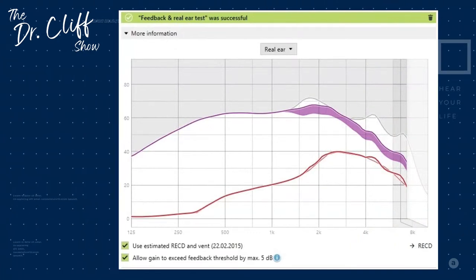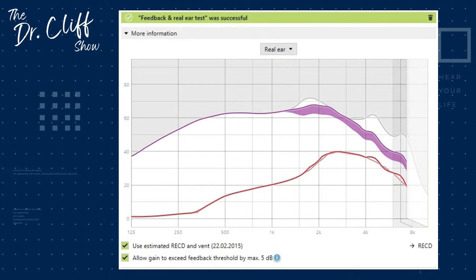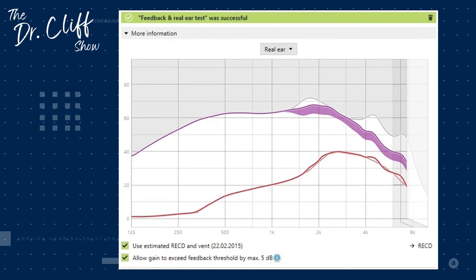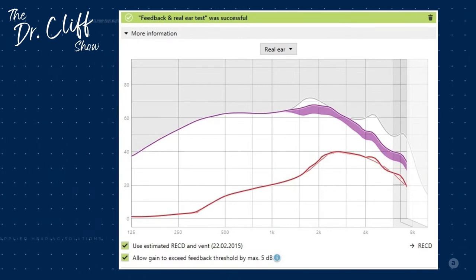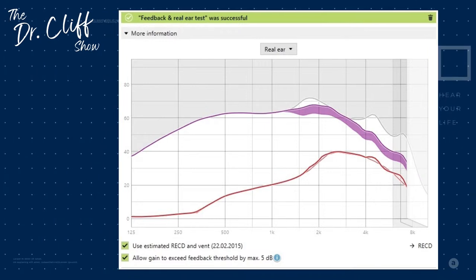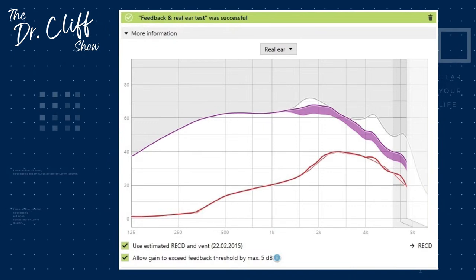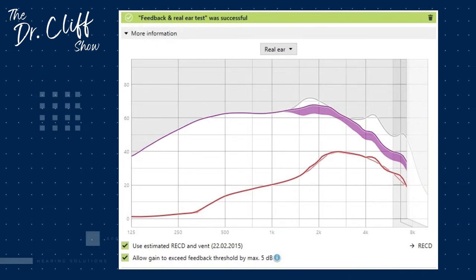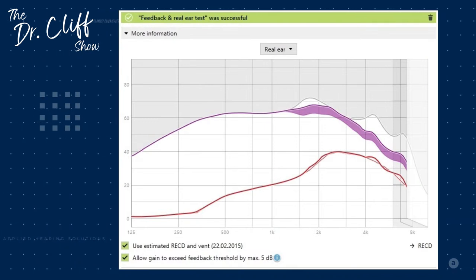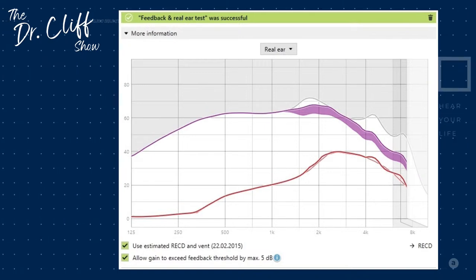And we can see this is actually a really good example of a feedback curve with a particular earpiece. I would guess in this particular case, we had a custom ear mold that is not allowing a ton of leakage of sound, which is a good thing. As long as that purple curve is hugging up against that gray range at the top of the screen and it's not cutting down into the red curve there, that means that we are not at risk for feedback. So I would say from an acoustic perspective, if we put a dome or an ear mold on someone's ear or on their hearing aid inside of their ear, and we did this feedback measure and we saw this, we would say, hey, we are A-okay to move on to doing real ear measurement with this individual.